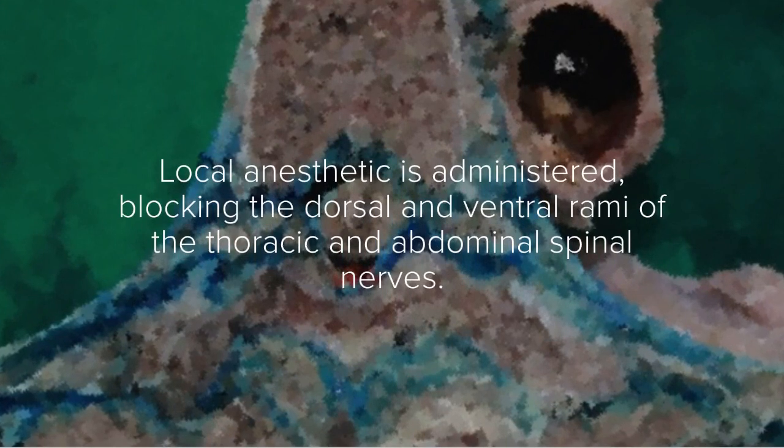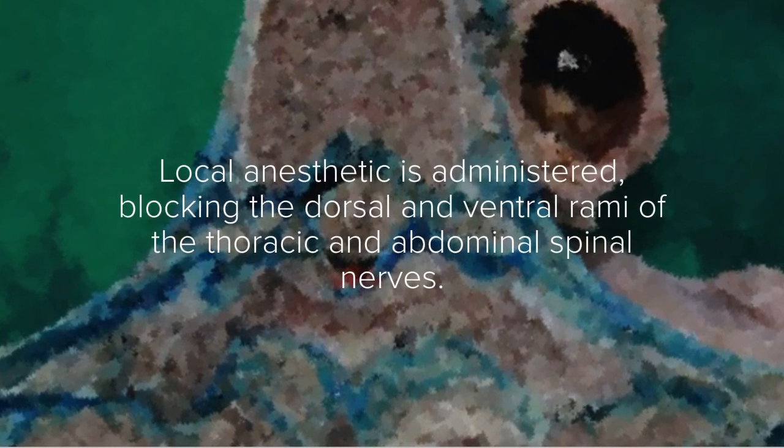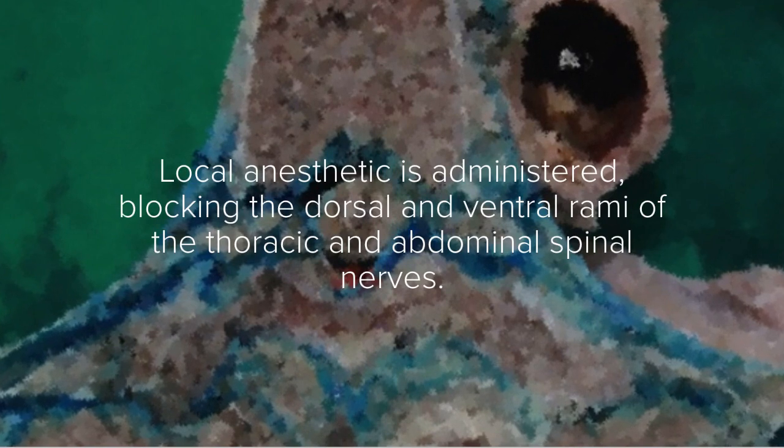Local anesthetic is administered, blocking the dorsal and ventral rami of the thoracic and abdominal spinal nerves.